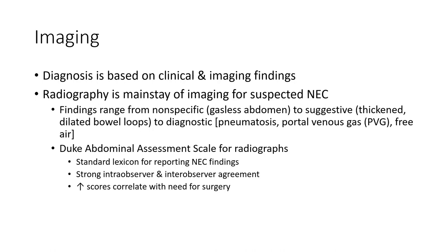The abdominal assessment score for radiograph is a standard lexicon for reporting and receiving findings, with strong inter-observer agreement. Increased score correlates with need for surgery.